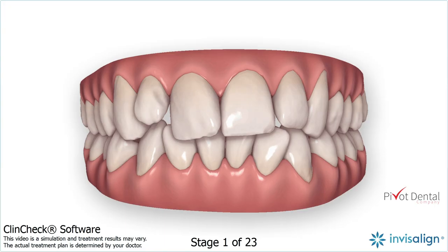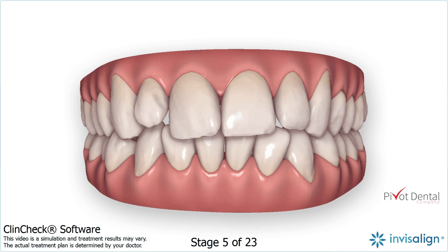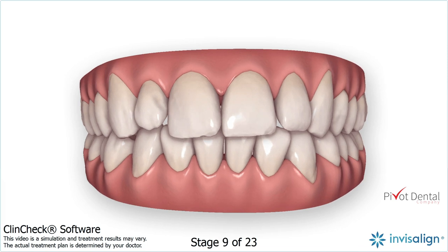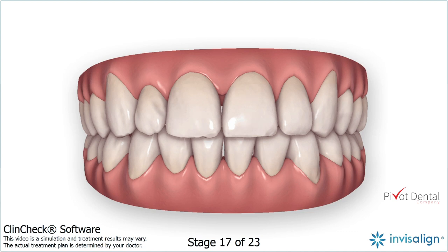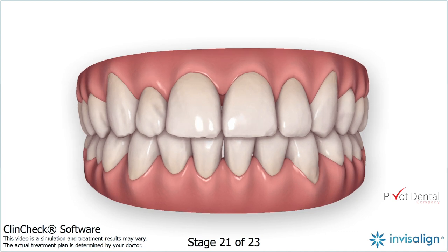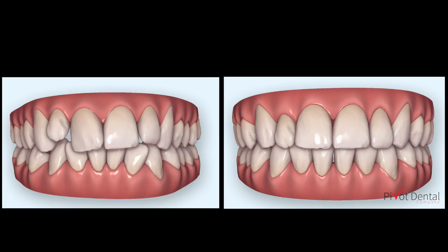If we take a look at the ClinCheck, you can see as we progress through the movie that the movement of number 7 is to pull it downward, or to extrude the tooth. I have found over the years that trying to extrude any teeth in Invisalign — specifically upper laterals — is a very challenging move, and sometimes it doesn't play out clinically as well as we'd like.